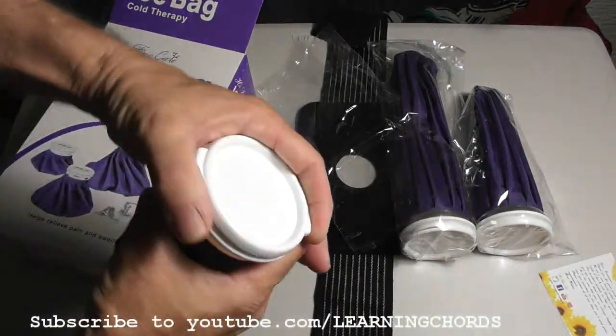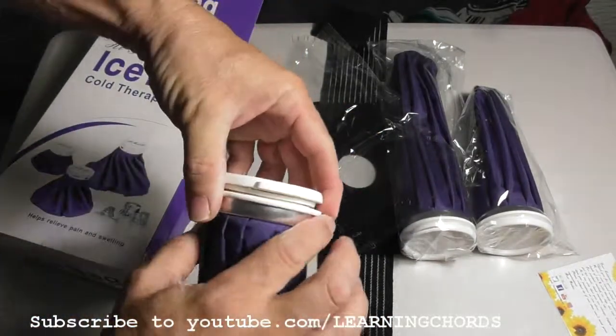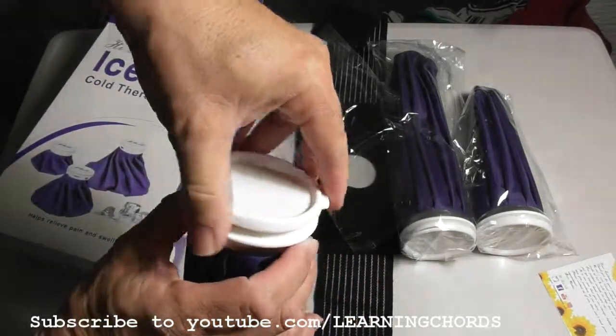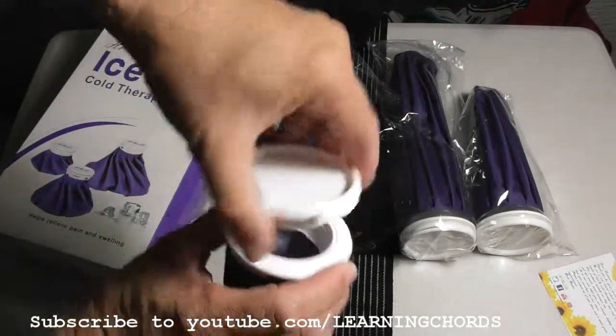It comes with an ice bag that's made out of high quality aluminum around the base, and the cap is made of leak-proof nylon.